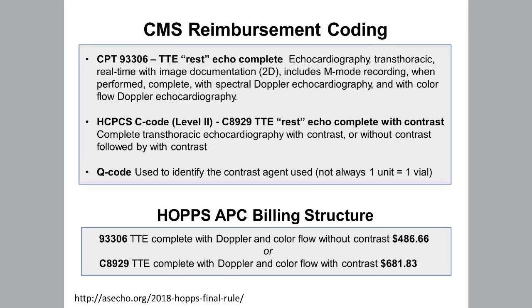All right. So for us, when we're assessing a patient for non-compaction, we do this over 2 injections for each view. Our first injection is, if I were looking at a normal ultrasound enhancement agent study, I would say this was too low. We give a very small injection where we send poofs of contrast through those deep recesses of the non-compacted myocardium, and it helps us get a sense of how the recesses are, where the endocardium starts, and how extensive that non-compacted myocardium is.